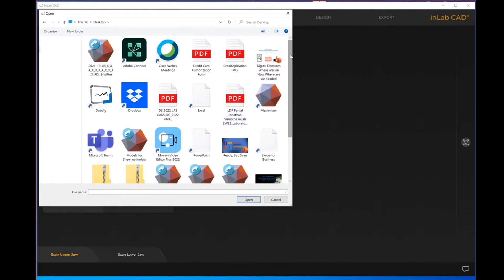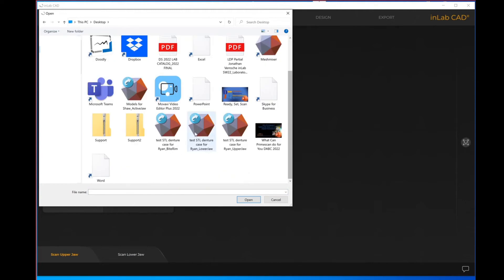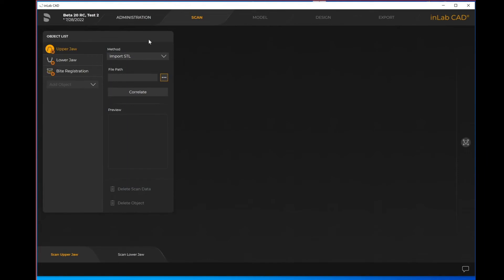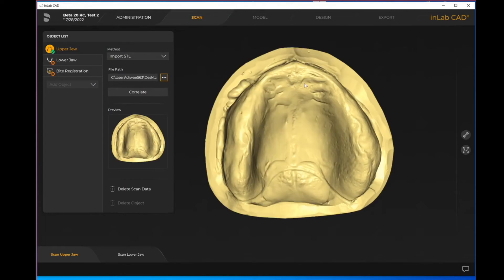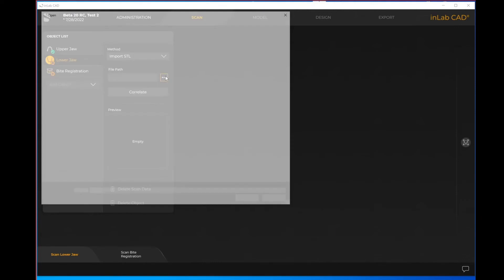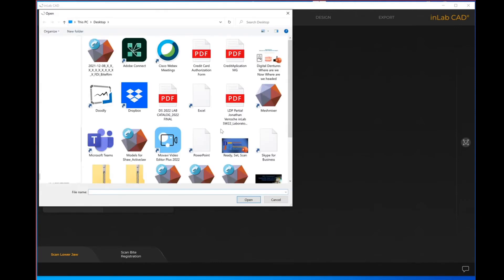Here I've got my STLs. It'll take just a moment to import that file with my upper jaw. You can see now the file path identifies where I've imported from, and then I just do the same thing with my additional objects.